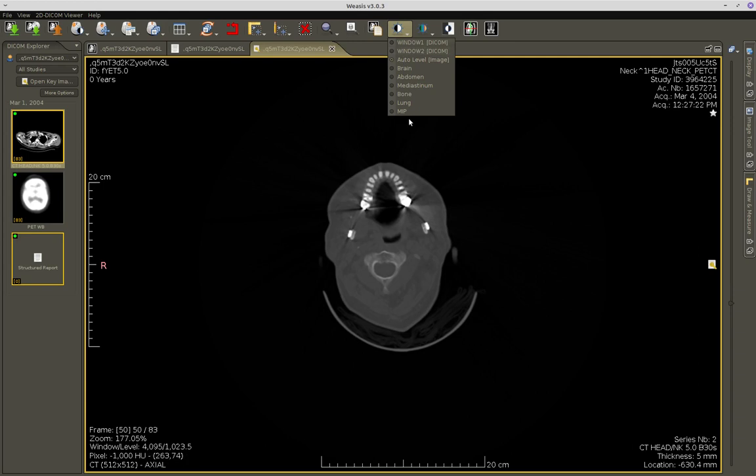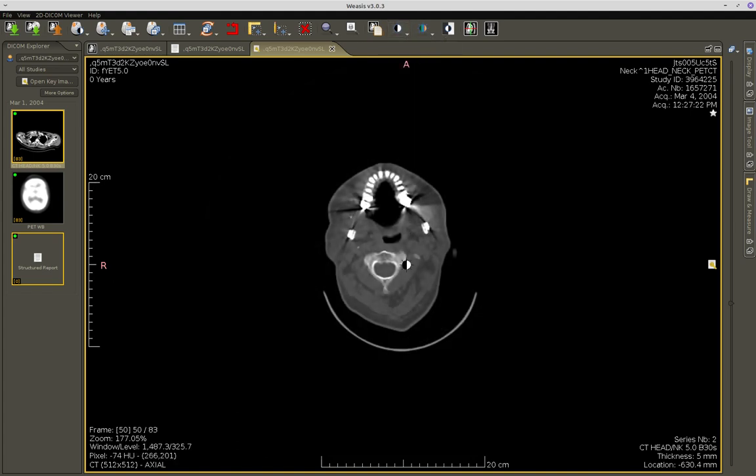As far as I remember, because I used this a long time ago, this can't generate a 3D model from these cuts. There are some tools that actually generate 3D models, and you can play and see.